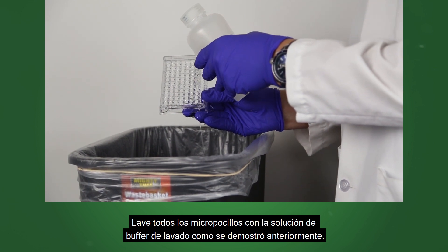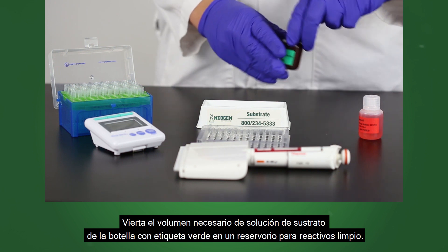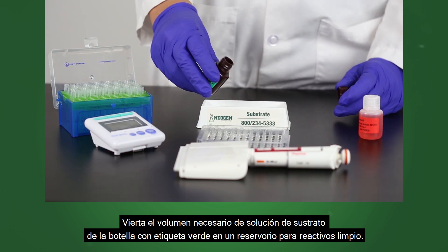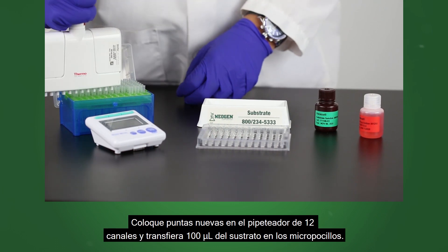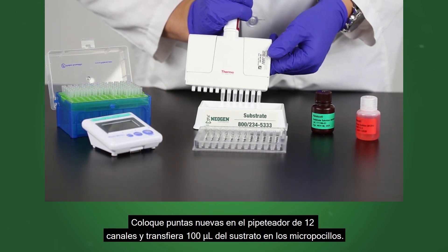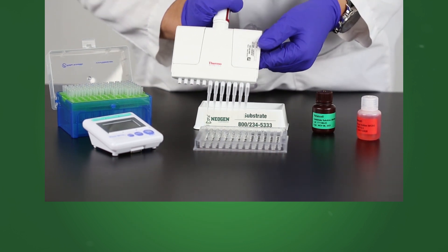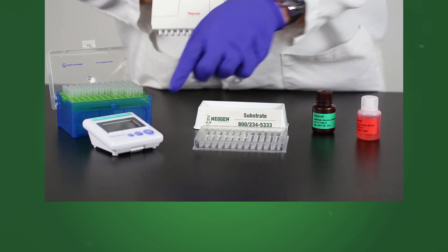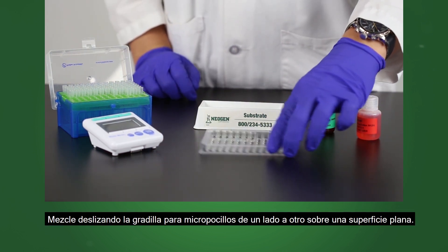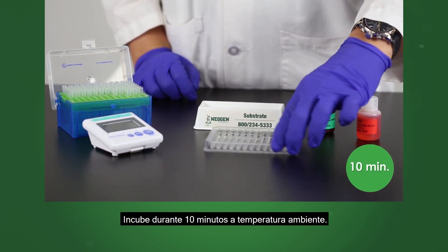Wash all wells with the wash buffer solution as demonstrated prior. Pour the needed volume of substrate solution from the green labeled bottle into a clean reagent boat. Place new tips on the 12 channel pipetter and transfer 100 microliters of substrate into each well. Mix by sliding the microwell holder back and forth on a flat surface. Incubate for 10 minutes at room temperature.